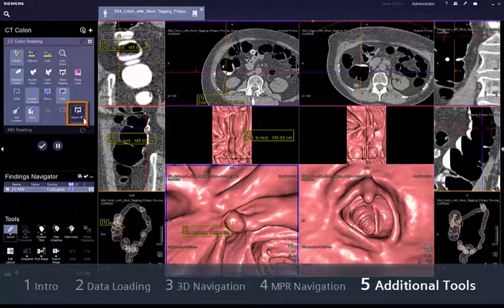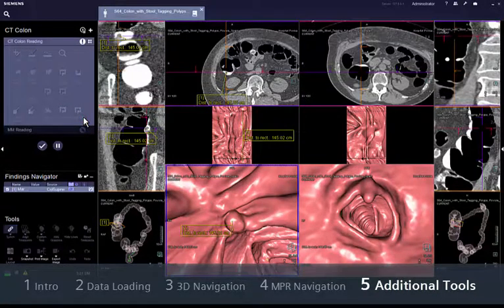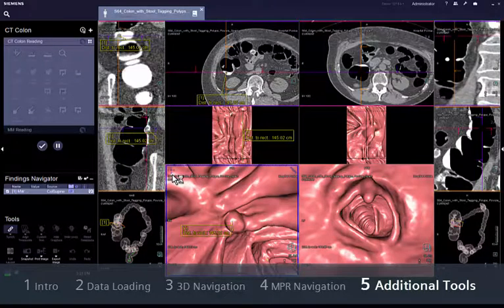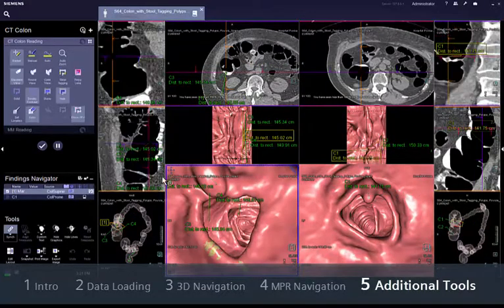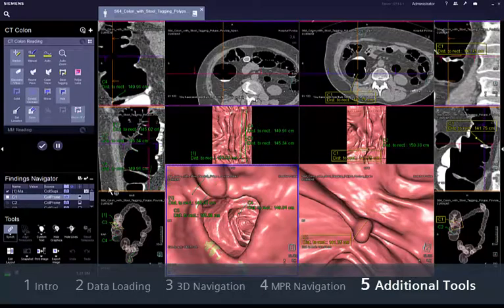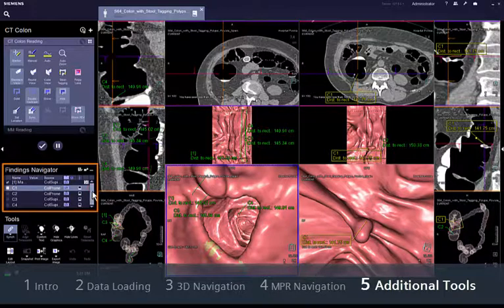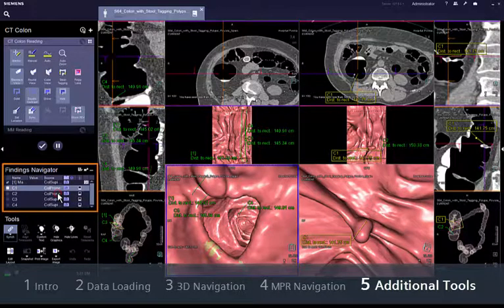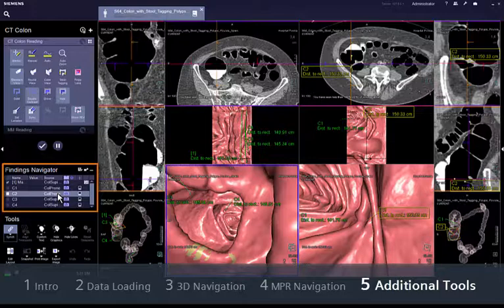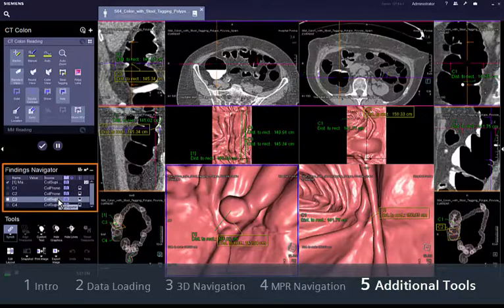Click on Show PEV to display the results from our second reader tool. It will help you identify solitary structures that are consistent with polyps with respect to shape, density and connectivity. A list of PEV findings is shown in the findings navigator for you to review. To distinguish them from user findings, the PEV findings are shown with a computer symbol.